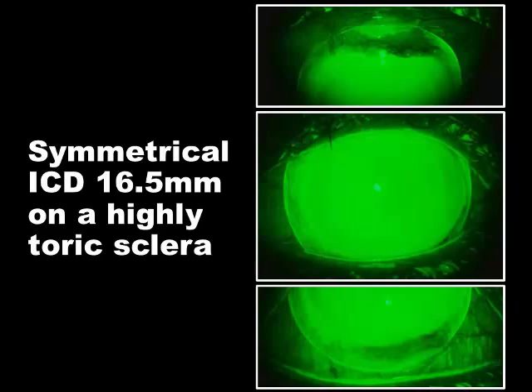When we place the symmetrical ICD on this patient, notice where it lands at 12 and 6 o'clock. It vaults at 3 and 9 o'clock. You can see the patient's habitual lens where it was digging right into the conj. The tip had sunk itself completely in at 12 and 6. So did we do any better with the ICD on this patient? The answer is no, we didn't, because it's such a toric sclera. We needed a toric ICD lens.